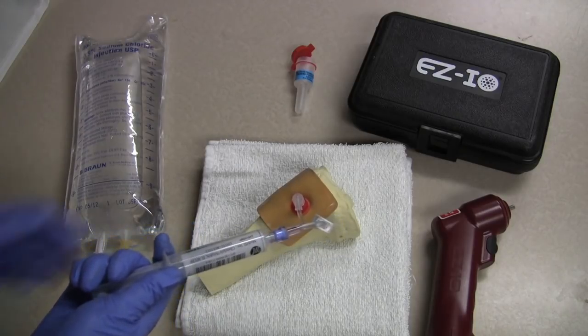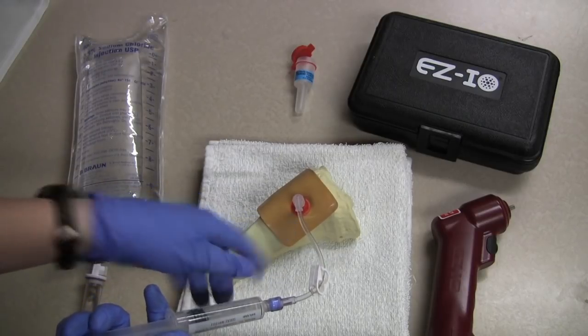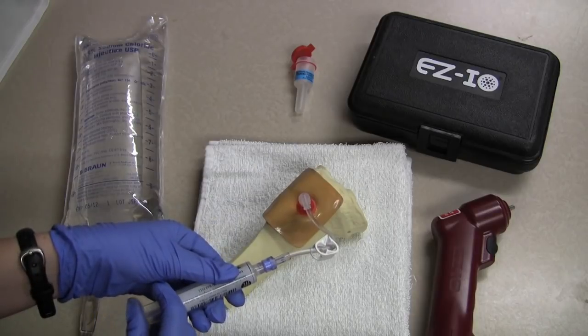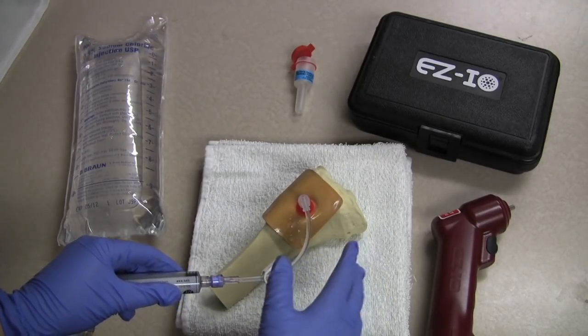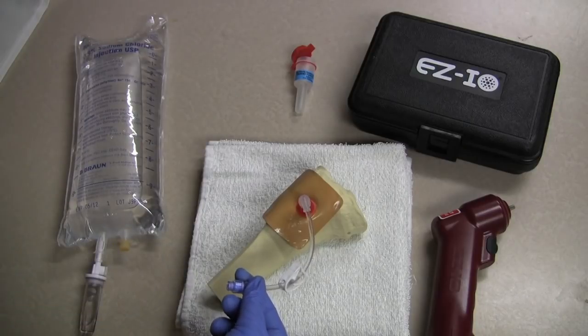We are going to aspirate a little of the bone marrow, checking our location, and bolus the rest of the sodium chloride. The reason we do this is so that we break up that intricate network of bone so that the IO fluids flow a little easier.